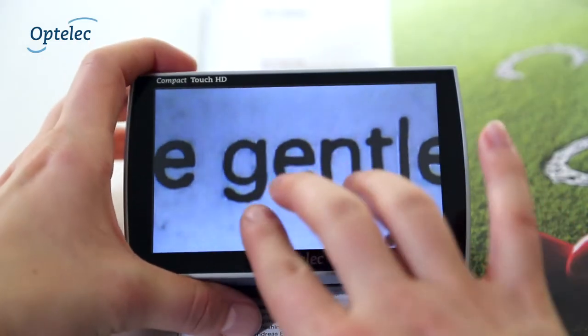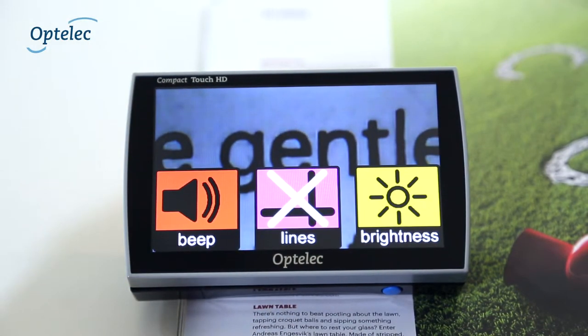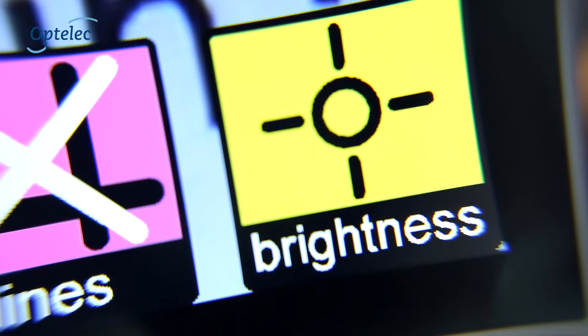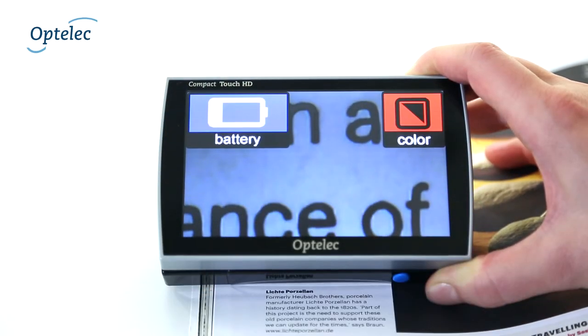If you want to modify other settings of the Compact Touch HD, swipe from the top to the bottom or from the bottom to the top with three fingers. Now you have access to the informational menu with large print icons for sound, brightness, reading lines, or the battery level and display mode.